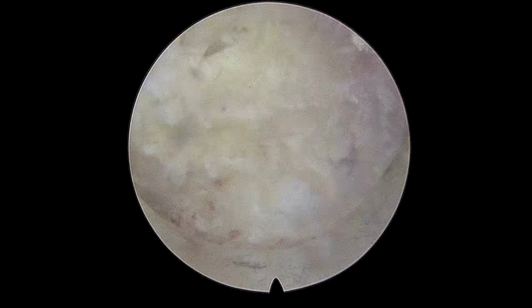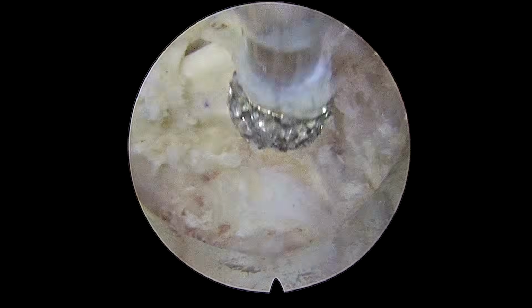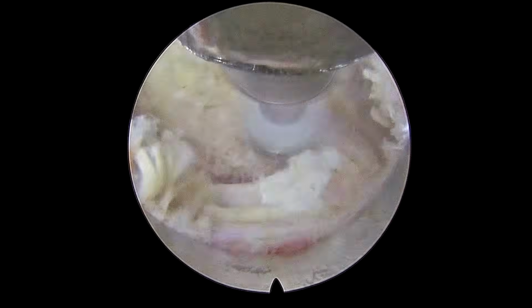Now I'm burring the superior margin of the inferior lamina here. I'll make the inferior lamina thinned out so that I can remove the lamina with the help of a Kerrison punch.